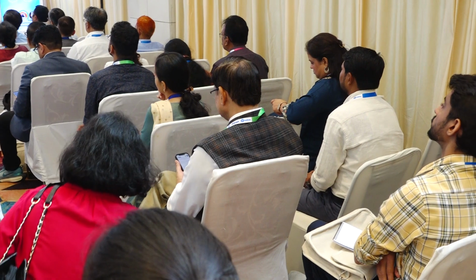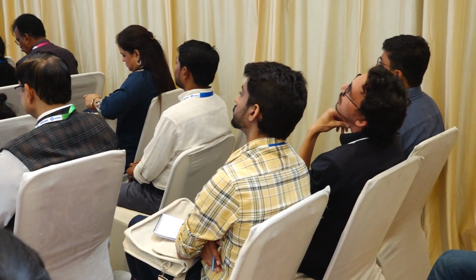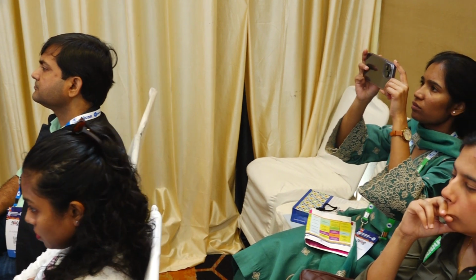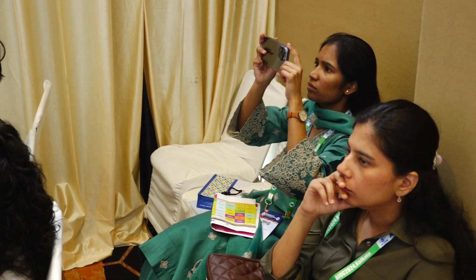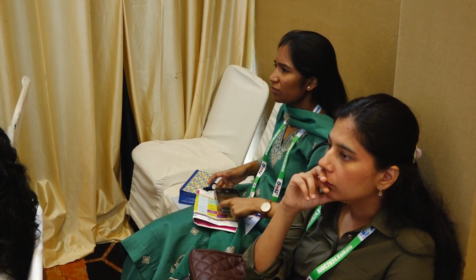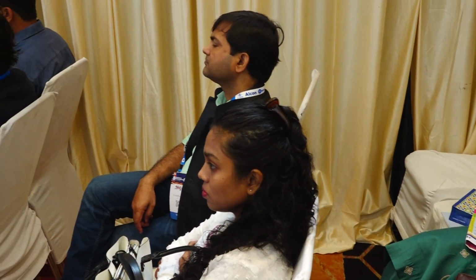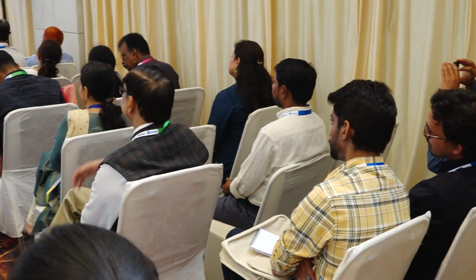I think Dr. Urvija has covered the piezoelectric quartz crystal which is present in the handpiece, so I won't be repeating that, basically converting the electrical energy into ultrasound energy, and they're 2 to 4 in number. One thing I would like to mention here is that the more the number of crystals, the more the stroke length. That stroke length is the one which tells us how much power is going to be delivered. Suppose 2 to 6 crystals are present in the handpiece.